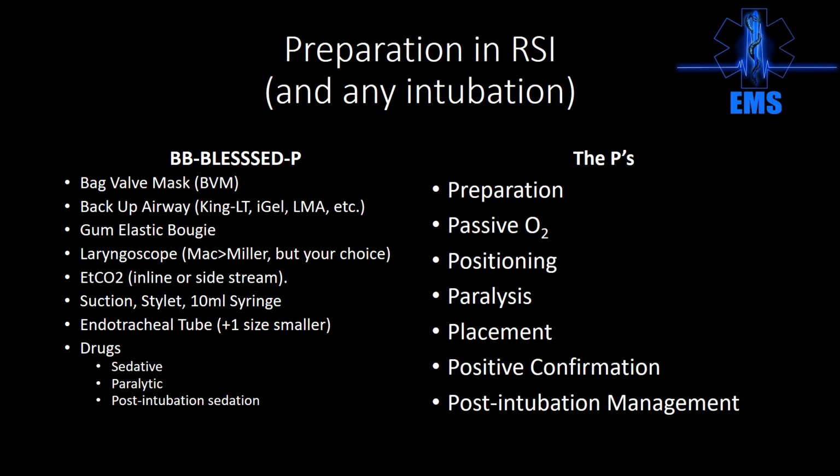Of that 10 mLs, you don't need 10 mLs of air, you need about 7. So do not fill this thing up like a Macy's balloon on Thanksgiving. Just fill it up with about 5 to 7 mLs. Your pilot balloon, that little balloon that comes off the tube there, confirms that your balloon is up at the distal end, needs to be pliable and should yield to gentle pressure. You should not squeeze that thing like you're popping a zit in your Dr. Pimple Popper.